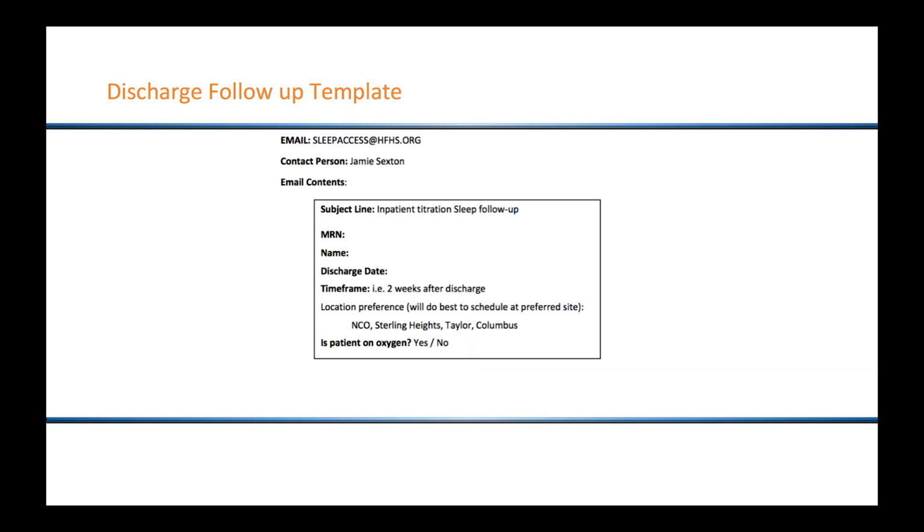The template that you'll use is, in the subject line, place inpatient titration sleep follow-up, place the MRN, the name, the discharge date, the time frame, typically 2 weeks after discharge, select the location most convenient for the patient, and what the patient's oxygen requirements are for discharge.